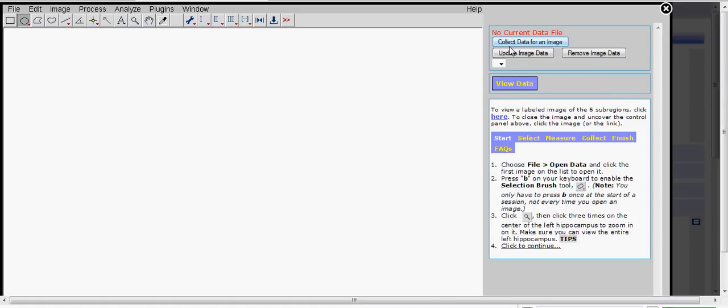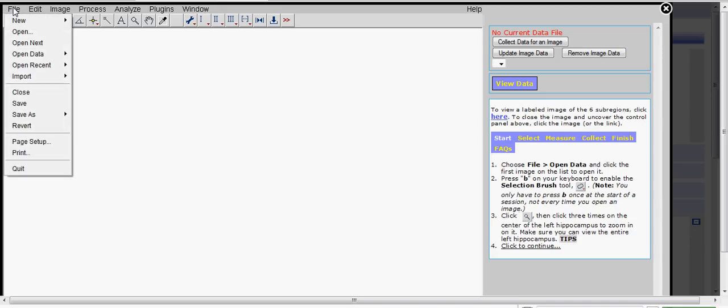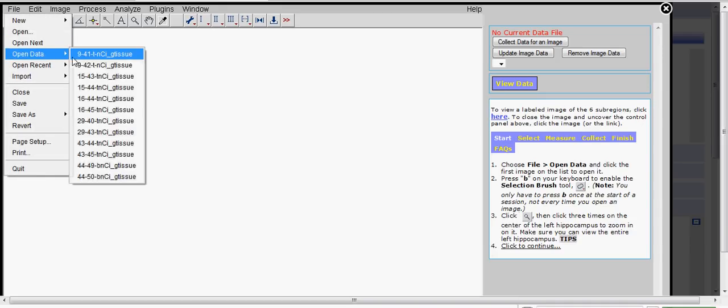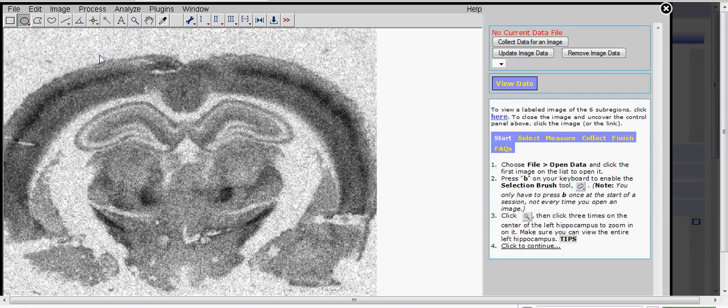To open the first image, pull down the File menu and click Open Data. Click on the first image.